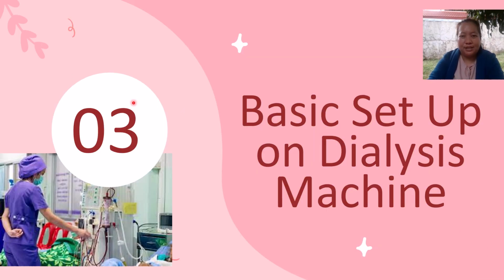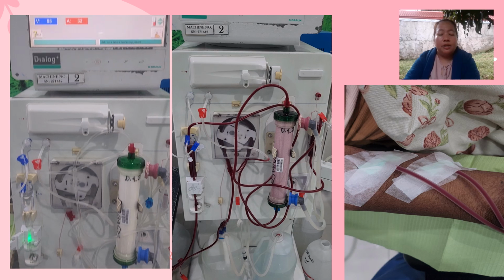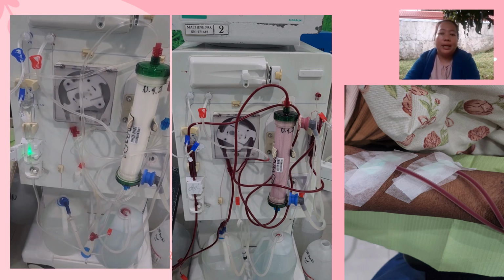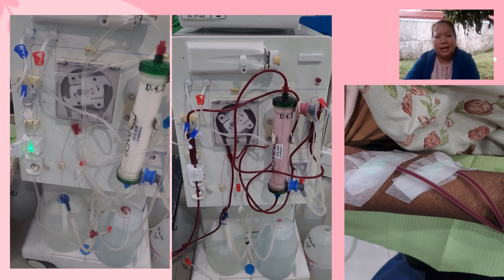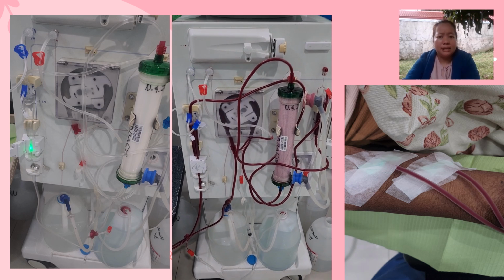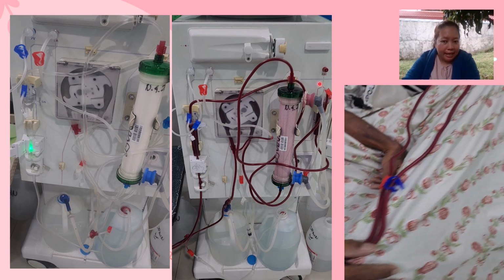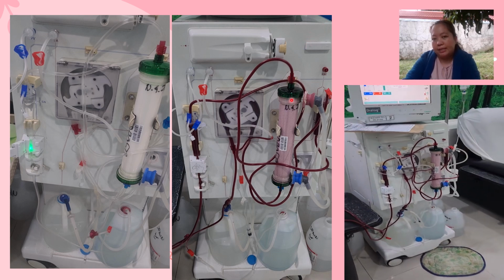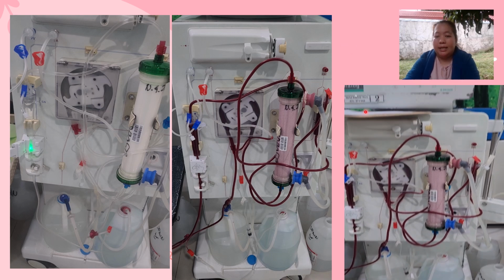As a nurse, you need to know the basic setup of dialysis. Here's a video of what the machine looks like. The bloodline is primed with plain NSS and everything is calibrated. I will make another lecture for this in actual, as a video presentation will be difficult to do in an actual setting. So as you can see, this is the Bbraun machine. And in here, you can see what happens when there is already ongoing dialysis with the AVF fistula, and what happens during dialysis.